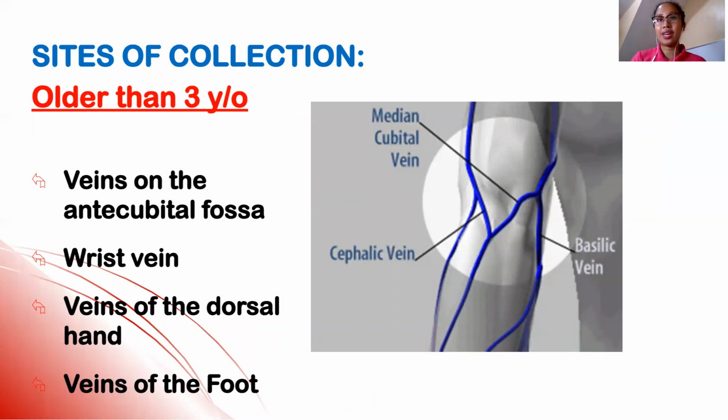And we have basilic vein. So, your basilic vein, yung katapat ng pinky. Yan, dito sa area to. So, basilic vein is really not well anchored. It is the least anchored. So, ibig sabihin gumagalaw siya. It rolls. What else? Class, under it is the brachial artery. So, if you're not careful, you could puncture the brachial artery.